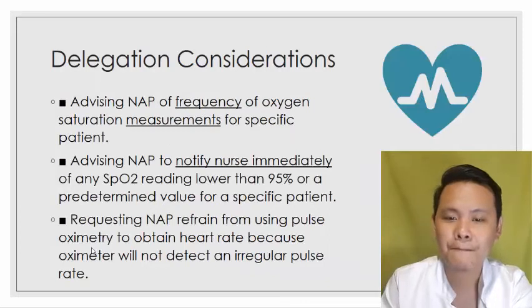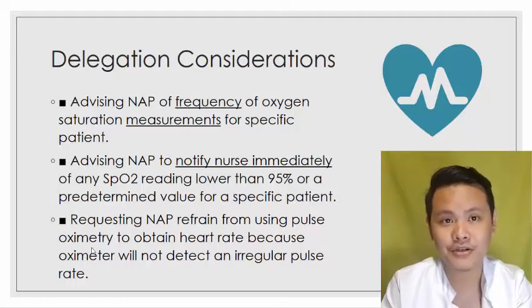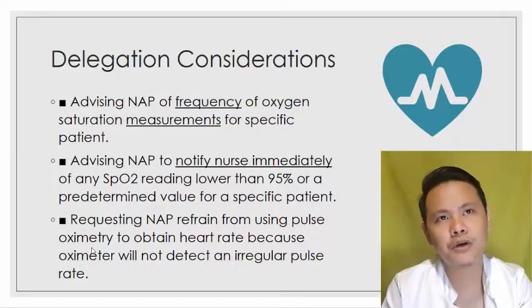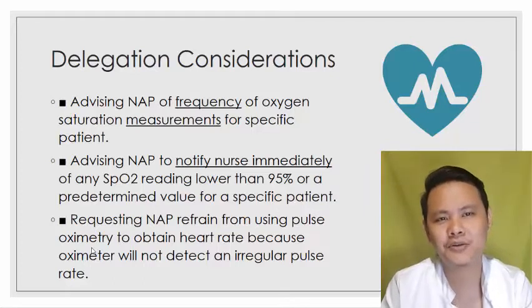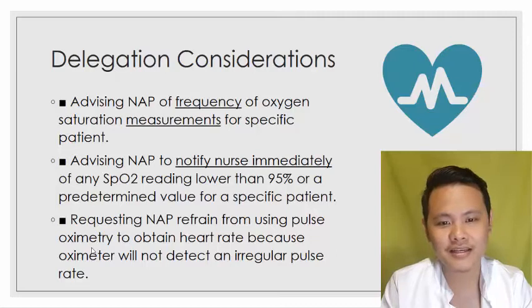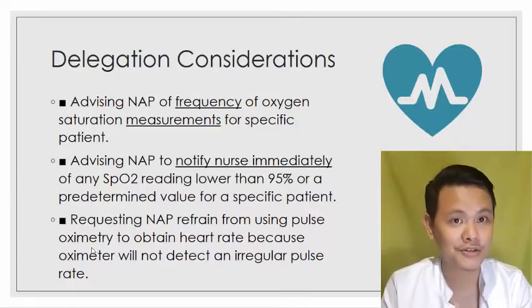Okay, what else? We have to advise our NA about the frequency, kung gaano ba kadalas tayong kukuha ng oxygen saturation. But actually, sometimes it depends din sa order ni doc. Okay, nakadepende rin yun. There are some doctors who will tell you na monitor mo yung kanyang oxygen saturation every hour. So, sundin natin yun. And then we have to tell that to our NA. Okay, what else? We have to advise our NA to notify the nurse immediately. I-notify niya tayo immediately kapag mayroong problema with the oxygen saturation.